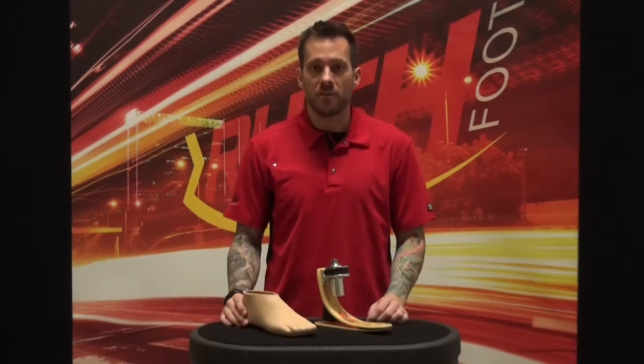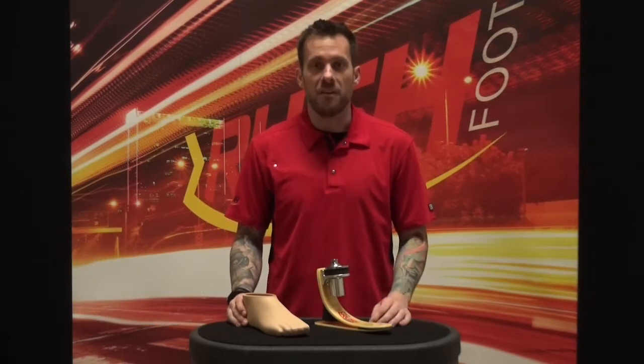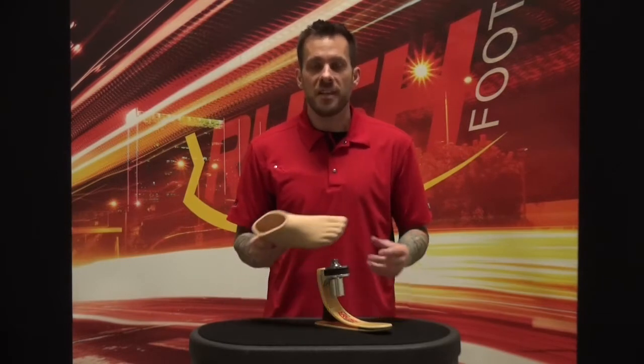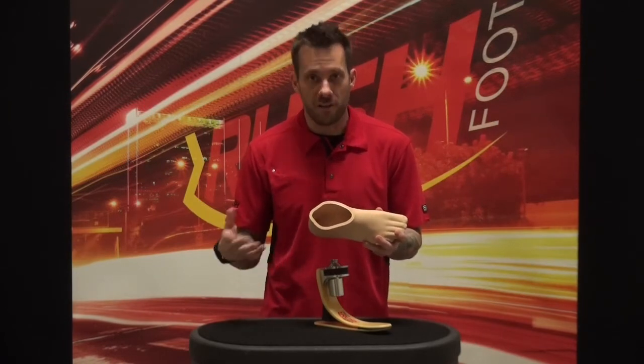Today we're going to talk about how to easily don and doff your foot shell. It can be a little bit tricky, but with a little bit of muscle and these tips, I think it'll make it a lot easier to do. So first, let's take a look at the inside of the foot shell to help you better understand how its construction comes into play with the actual donning and doffing.